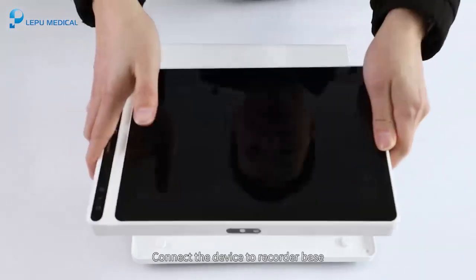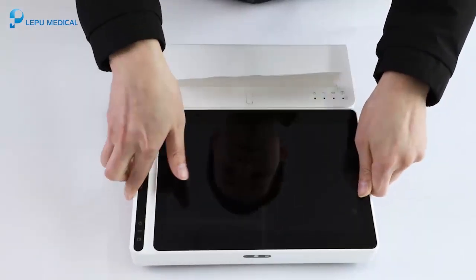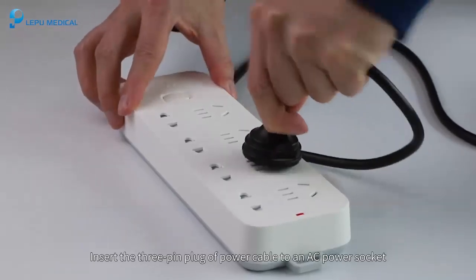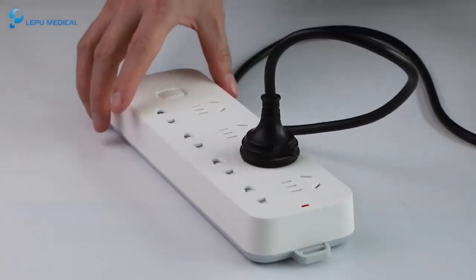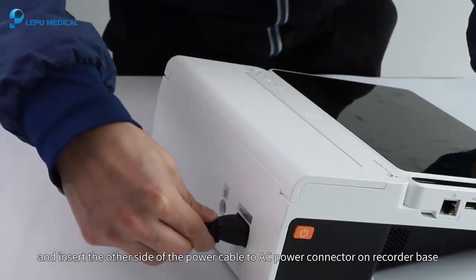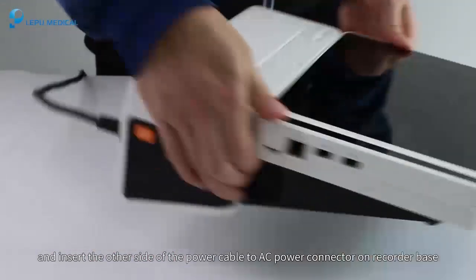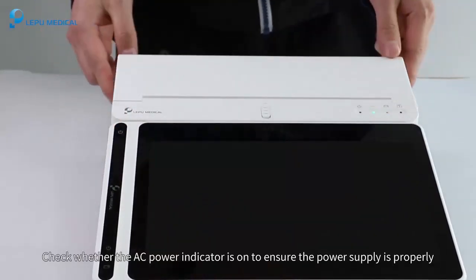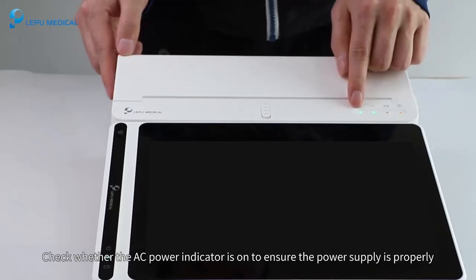Connect the device to the recorder base. Insert the 3-pin plug of the power cable to an AC power socket, and insert the other side of the power cable to the AC power connector on the recorder base. Check whether the AC power indicator is on to ensure the power supply is proper.